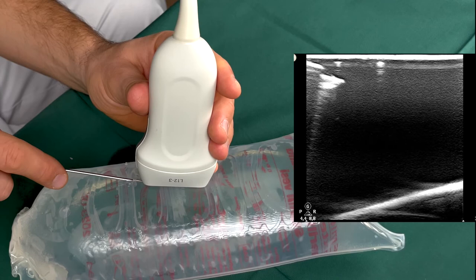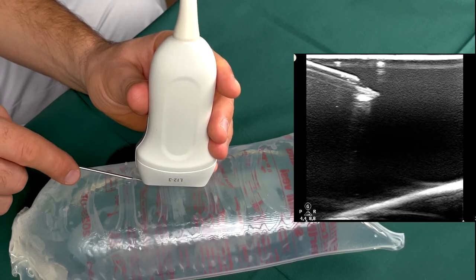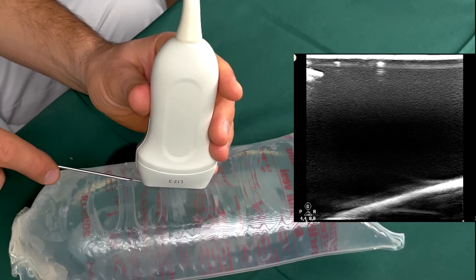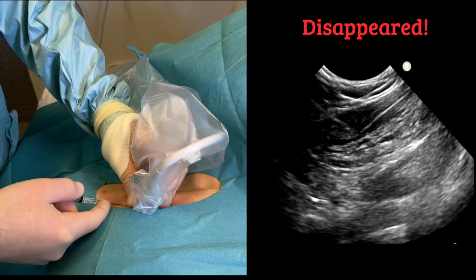Now we approach the target. We want to see the steel at all times, so don't accept tissue movements as a substitute. If you do not see the tip, do not advance the cannula. You may experience that you have a seemingly perfectly aligned probe and cannula when all of a sudden the cannula just disappears. Relax — no sudden movements. Don't move the probe; you don't want to lose sight of the vein. The field and the cannula are probably still parallel if you haven't done anything rash — they're just not perfectly aligned. The solution is lateral displacement: shift the cannula sideways, and it will pop into view again.